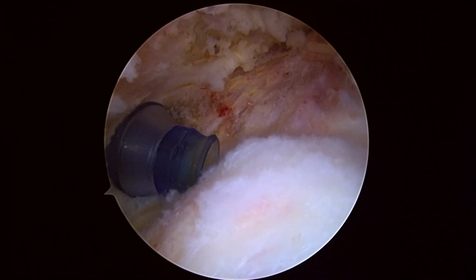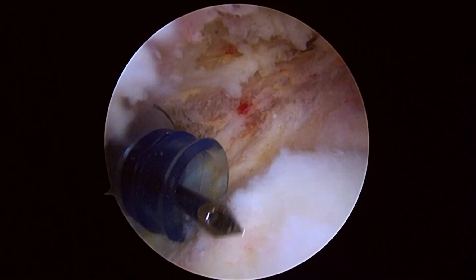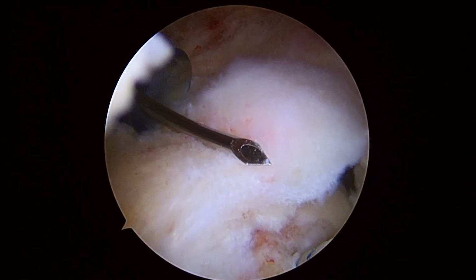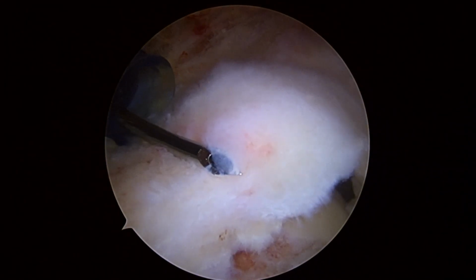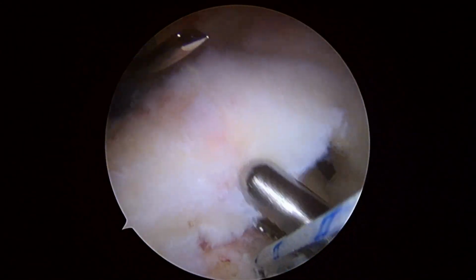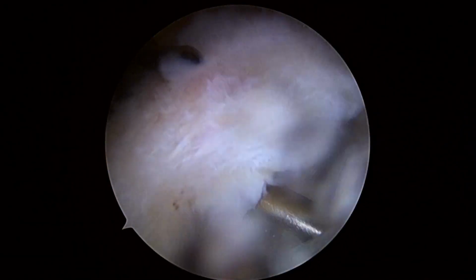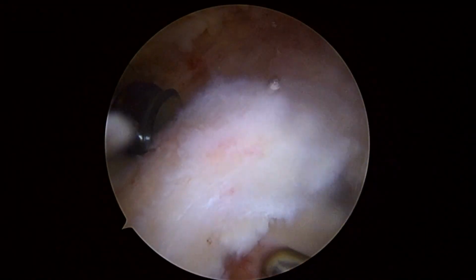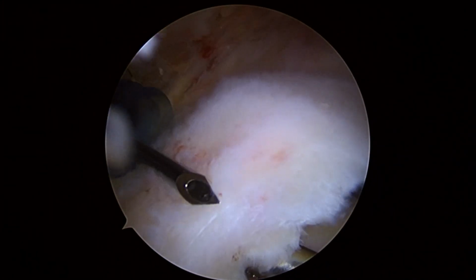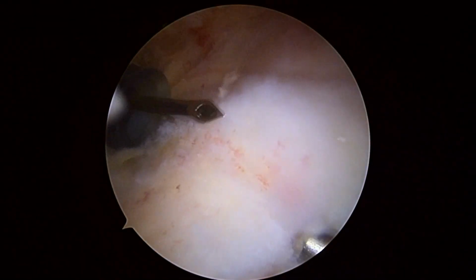Grasper in the front, great. Here's our hook. It's loaded with a black wire called a super shuttle. You can see it there. This is basically the angle that we'd like. Hold that right there, please. And so we can help by lifting up a little bit on the tissue, making sure we're getting all the layers. Okay, I've gotten a hold of the deep layer there. And again, I just want to make absolutely sure I've got everything.